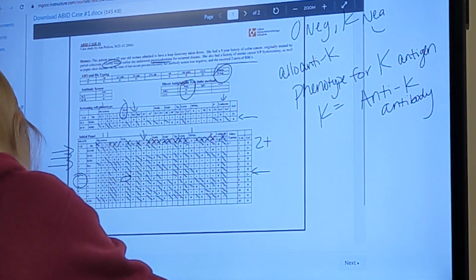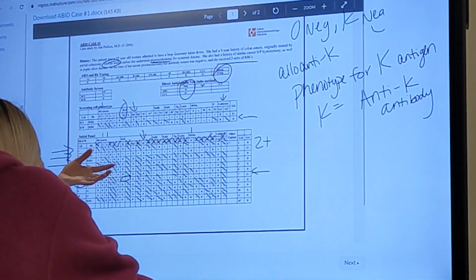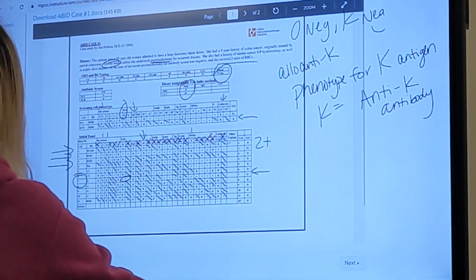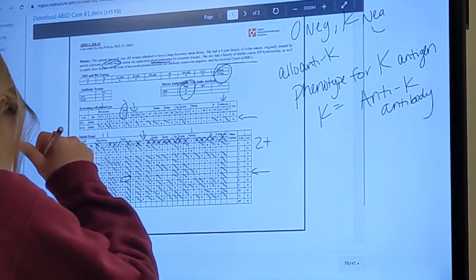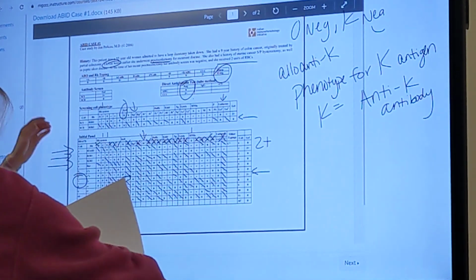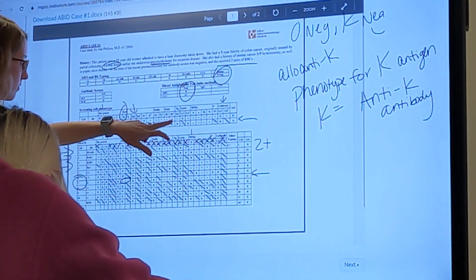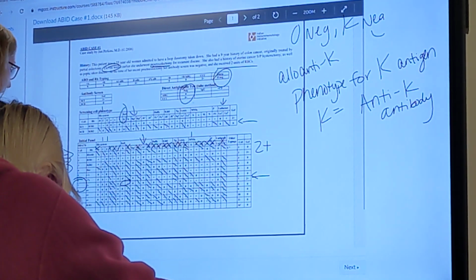If you gave a KPA positive unit, which is probably still not going to happen, because the likelihood you're going to pull a random unit out of all your units that has that on it is very unlikely. That's why we don't even say I couldn't rule it out, because it's probably not there. Another one we didn't worry about was XGA, we're not worried about that.